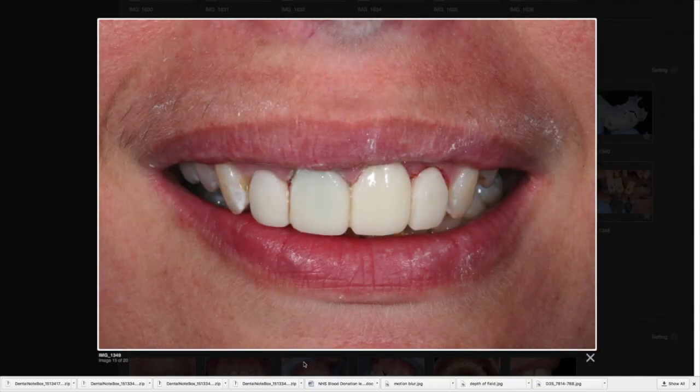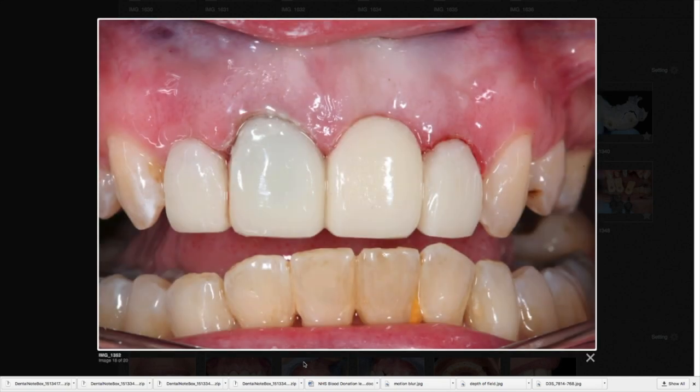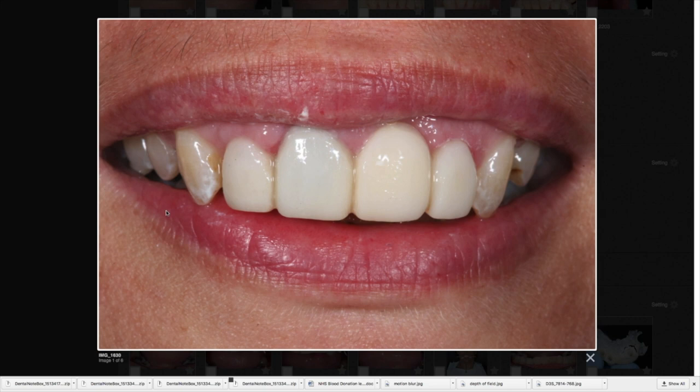Then you realize your lab wants a stump shade, so you take stump shades of the teeth. Then you just work on the temporaries until they look exactly right - you can add flowable and carve it, then put Luxor Glaze on to polish it up and make it look a little bit natural, adds a bit of warmth to the teeth as well. That dark post is still showing through, which should be an alarm bell for what's to come. But I'm pretty happy with the temporaries and she's pretty happy too. I let her go home to test them out, make sure she's really happy, and then we take a mold of them and say to the lab: copy this. A few weeks later she comes in, really happy, everything looks great, gums have healed up. So we take an impression of it and tell the lab to copy it - that's my patient-approved provisional.